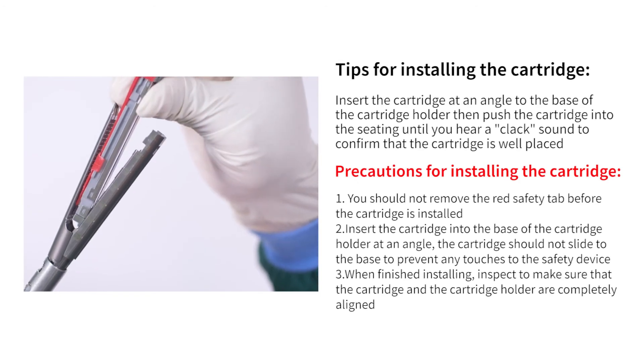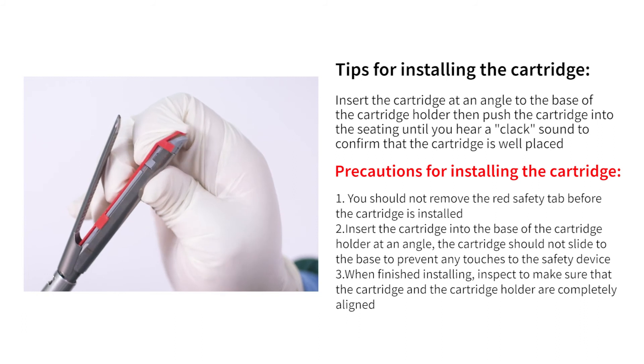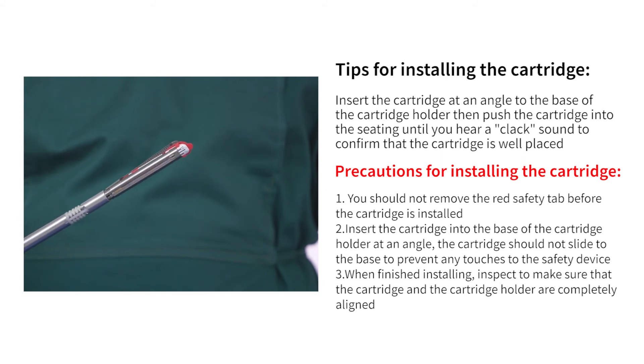Tips for installing the cartridge: insert the cartridge at an angle to the base of the cartridge holder, then push the cartridge into the seating until you hear a clack sound to confirm it is well placed. Precautions: do not remove the red safety tab before the cartridge is installed. Insert at an angle so the cartridge does not slide. When finished installing, inspect to confirm the cartridge and cartridge holder are completely aligned.